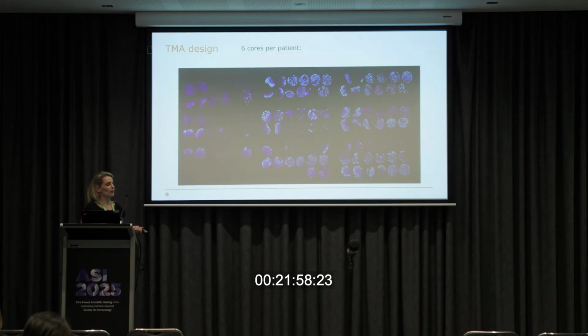So we end up with a TMA that looks like this. This is actually one of our neater looking TMAs. Anyone who's worked with TMAs will know we all see these perfect little grids, and they don't always work like that. Sometimes whole columns decide to go on a little journey in a different direction. You'll also notice that for some of them, it doesn't look like we've hit the tumour where we're supposed to. Some of them may be responders to treatment, and for others we haven't quite got the right spot.